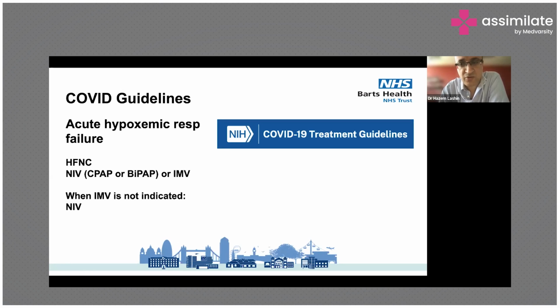So these days we can't talk about anything without mentioning COVID. This is the NIH of the United States COVID guidelines, but their definition of NIV is slightly different to what we've been talking about. When they say NIV, they mean CPAP or BiPAP.